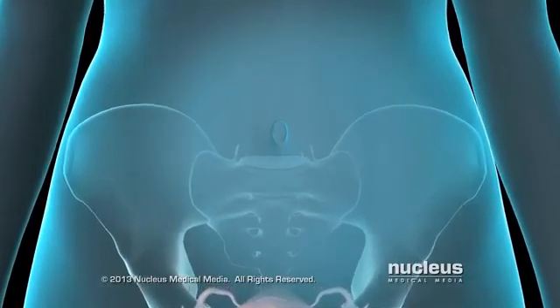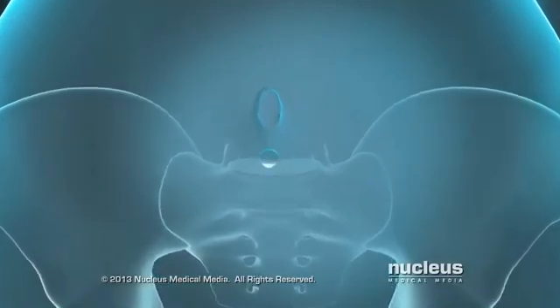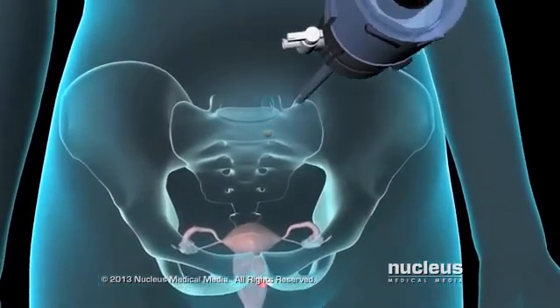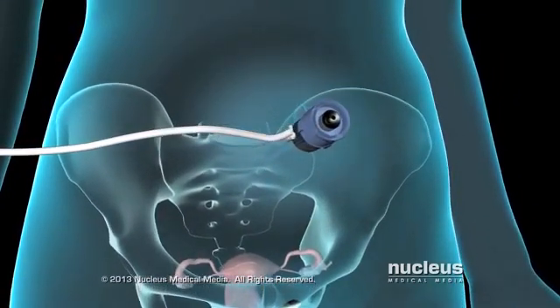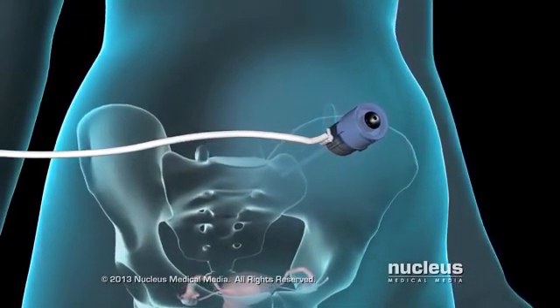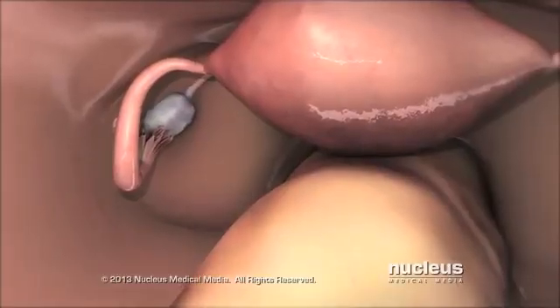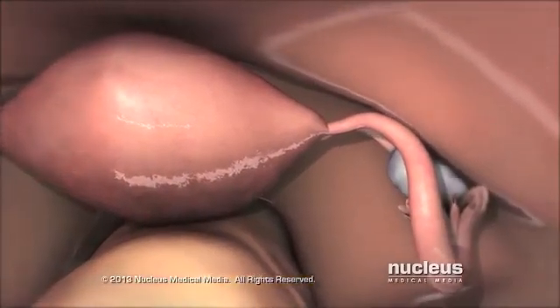If you are having a laparoscopic tubal ligation, your doctor will begin by making a tiny incision near your belly button and another just above your pubic bone. Your doctor will then inject carbon dioxide, a harmless gas, through a tube inserted into the upper incision. The carbon dioxide inflates your abdominal cavity, allowing your doctor to clearly see and work around your internal organs. Your doctor will then introduce a lighted instrument called a laparoscope through one of the incisions, which projects images of the structures inside your abdomen onto a monitor.